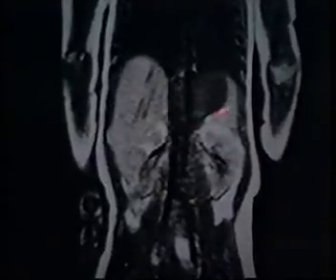It's a patient who had a mass first picked up on sonography above the left kidney, which was clearly cystic. I'll show you that here with some thick wall around it. Was this an adrenal lesion? You can go through the differential in your own mind. You can see in this coronal MR that there is a mass on the T1 weighted sequence. It's got a low signal intensity. It is about where the adrenal would be. It's clearly separate from the kidney, separate from the spleen.